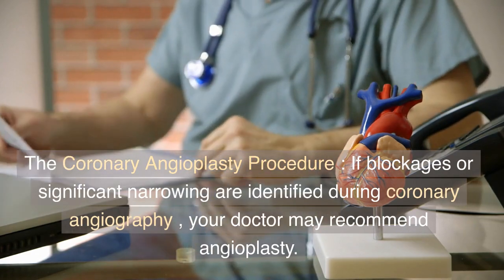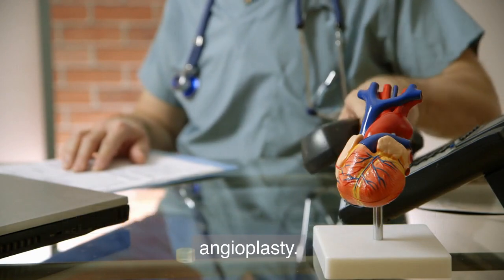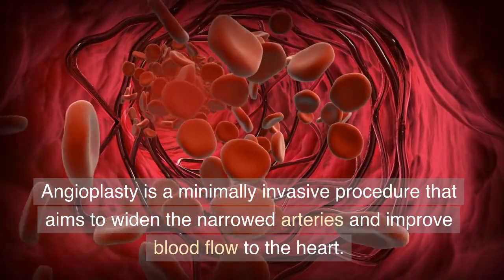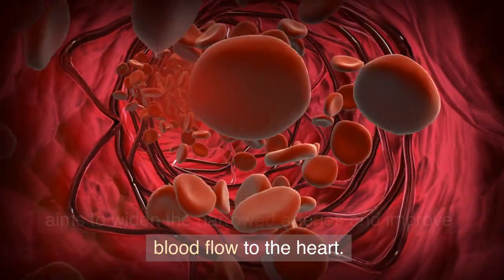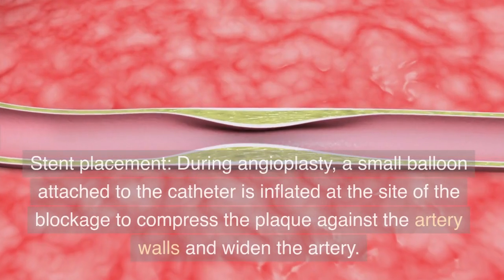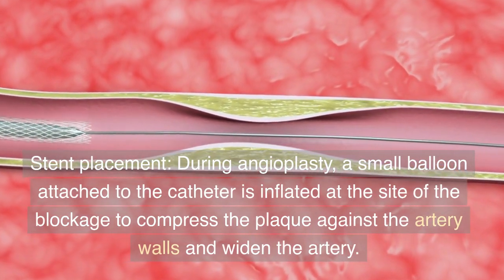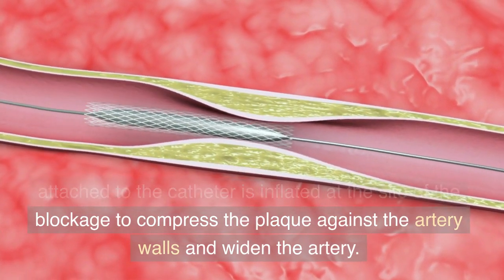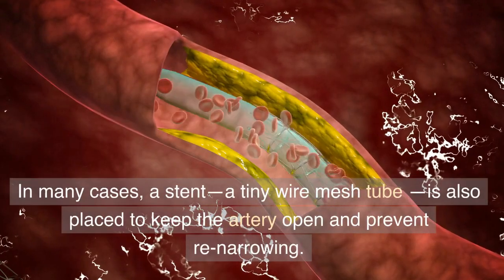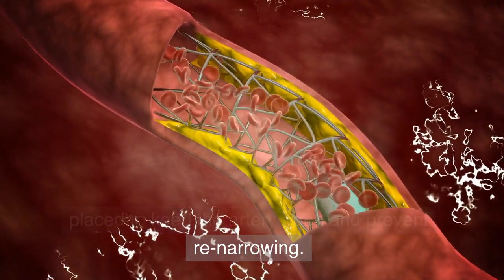The coronary angioplasty procedure. If blockages or significant narrowing are identified during coronary angiography, your doctor may recommend angioplasty. Angioplasty is a minimally invasive procedure that aims to widen the narrowed arteries and improve blood flow to the heart. Here are some key points to keep in mind. Stent placement. During angioplasty, a small balloon attached to the catheter is inflated at the site of the blockage to compress the plaque against the artery walls and widen the artery. In many cases, a stent, a tiny wire mesh tube, is also placed to keep the artery open and prevent re-narrowing.